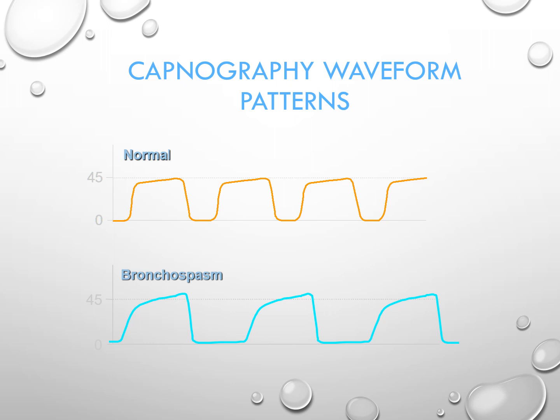In this particular example, it's showing you in blue there, that bronchospasm, where it's more like a shark fin, and it can get more dramatic than this. It can be even more sloped. And I would caution anybody looking at this slide: you walk into a patient's room, you see the shark fin, and you immediately think they're bronchospastic. I really caution you from doing that, because other things that inhibit exhalation and achieving that steady state can also contribute to it.